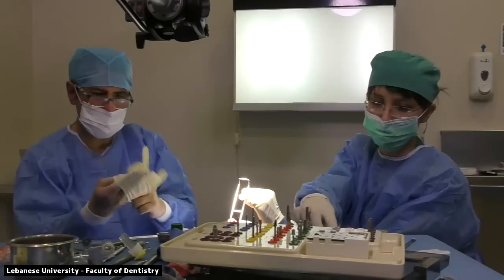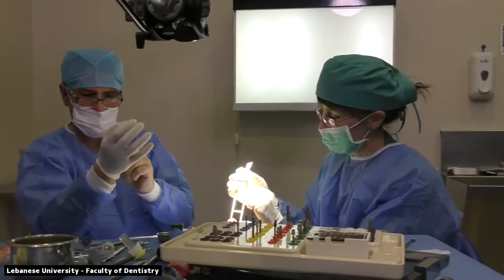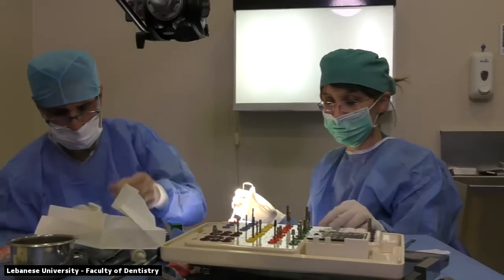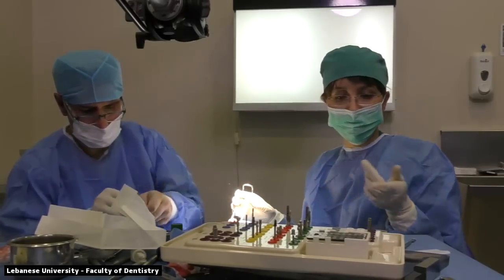In this case, we do have an extraction socket, so we already have bleeding in the site. There's no need to do any decortication at the buccal plate of bone because we have bleeding at the site.